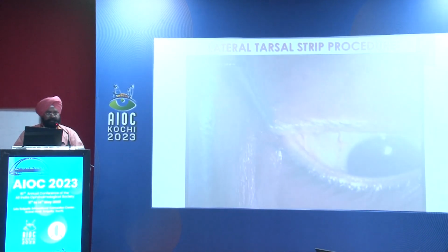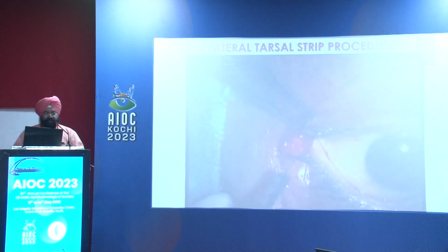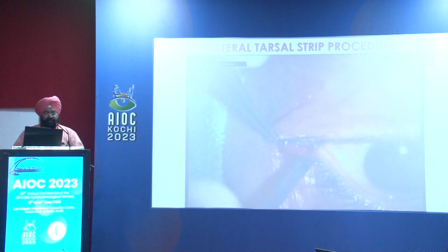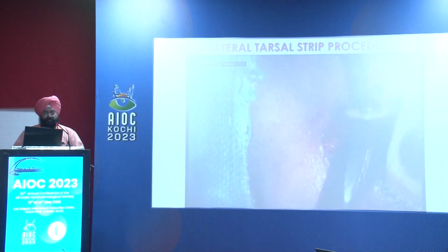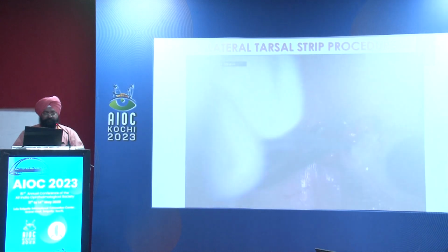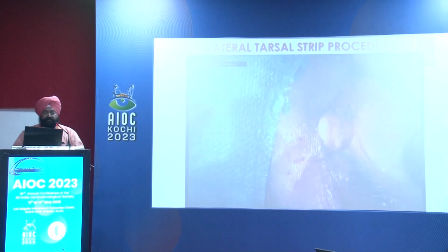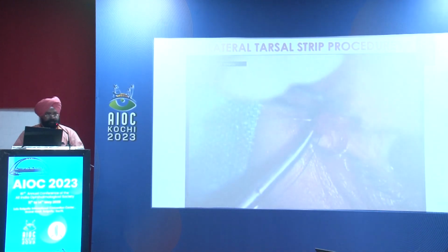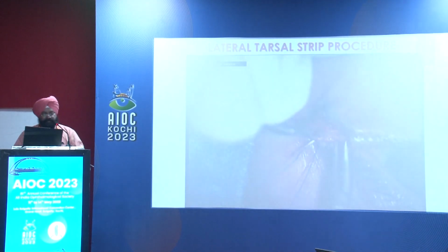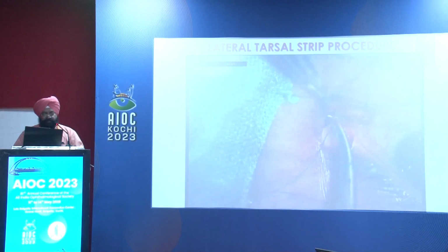I am tackling only the lower lid right now. So retract the lid and estimate how much of the lid has to be excised. RF cautery is the best tool for this, with cutting and coagulation. Cut away and separate the lid skin complex and cut the tarsus in the shape of a tongue. You have to pass the suture slightly inferior from the lateral tubercle, from the lateral margin, and a double arm suture is passed.